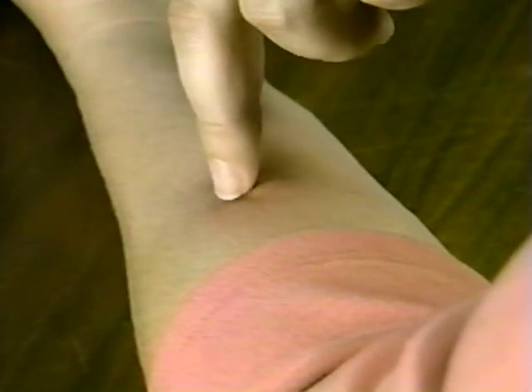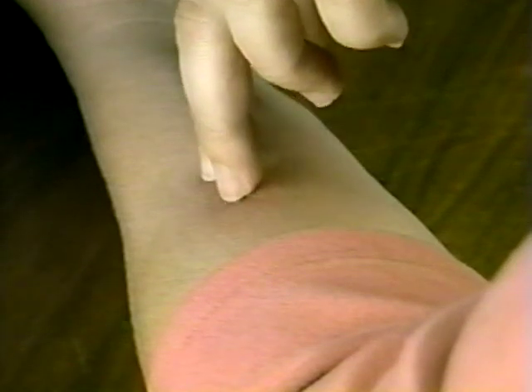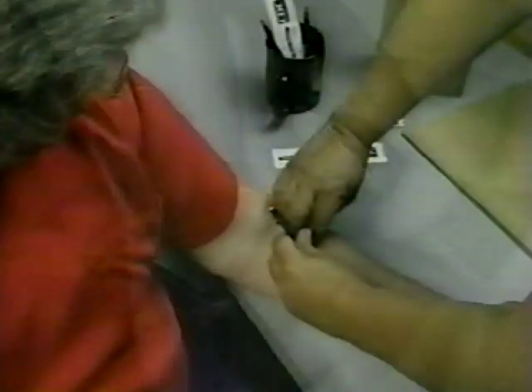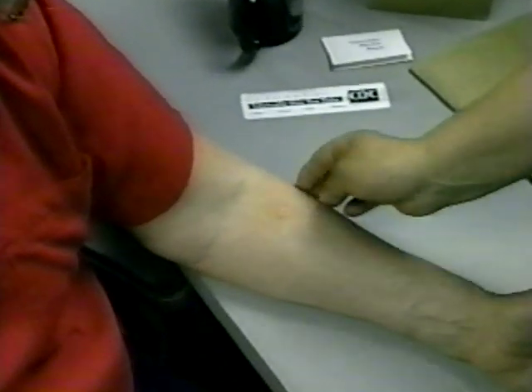If the margin is not equally clear all the way around the induration, it's still necessary to mark the margins on each side. Palpate around the induration from the easily felt margin to the not-so-easily felt margin. If the margins of induration are irregular, mark and measure the longest diameter across the forearm.